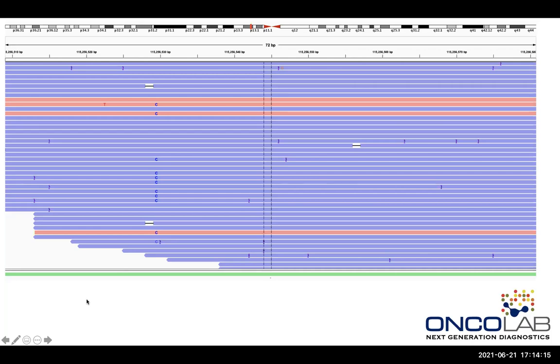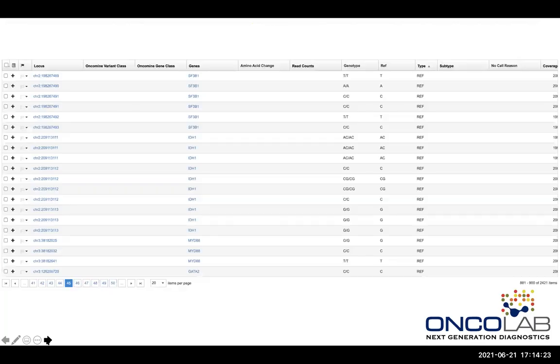Once you have this data aligned, we go and put it through filters, and this is where the bioinformatics comes in. So when I put through the data unfiltered, this is one patient. If you look at the bottom right-hand corner here, you'll see that it found 2,421 variants. Obviously, this patient doesn't have that much, and one has to go and filter it out further. So we use a cutoff of 5% or more to call anything on our myeloid assay, because we feel the noise below that starts to get statistically problematic.